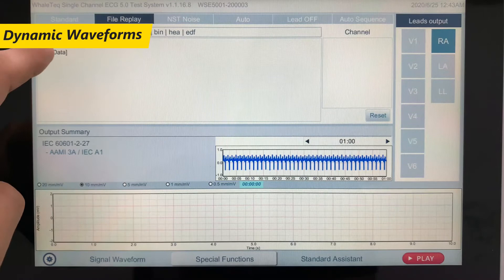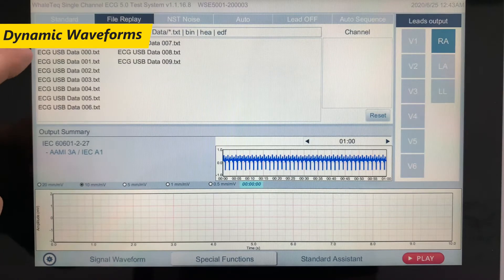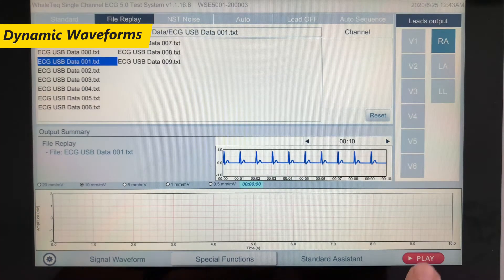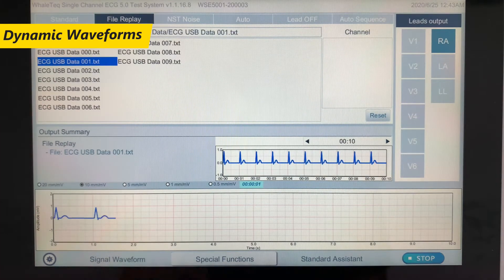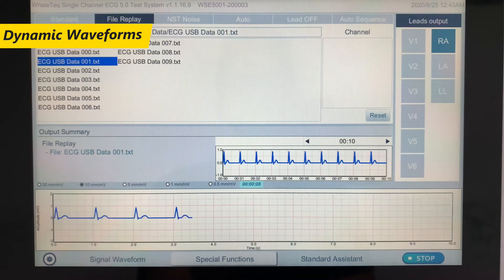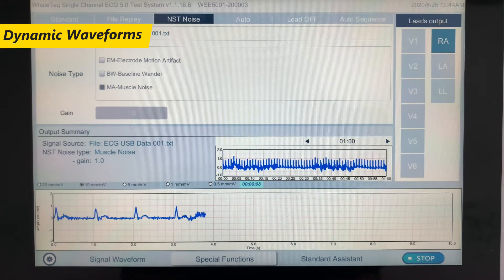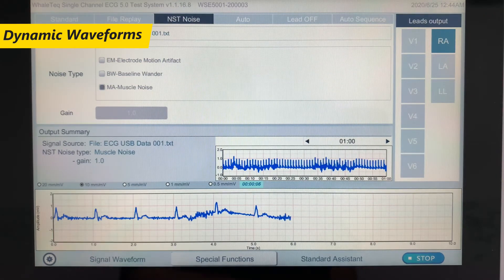Go beyond simulations by replaying single-lead ECG data from clinical trials or databases directly on SCCG 5.0. Combined with the NST noise function, you can easily test the variety of noise tolerance with real ECG waveforms.